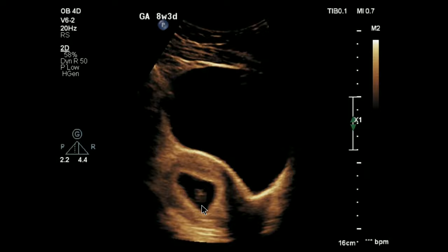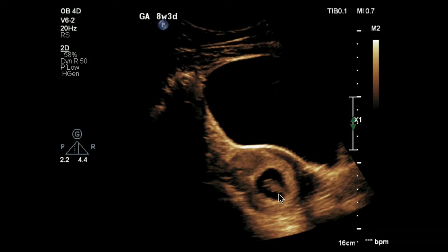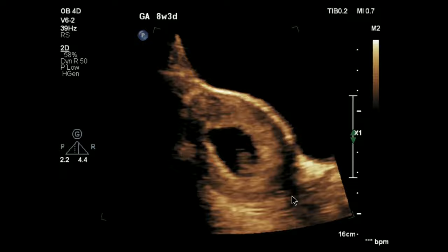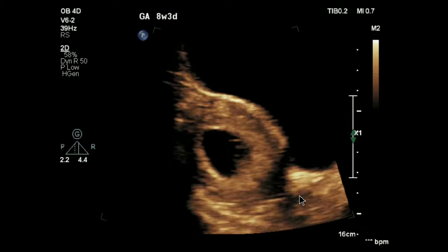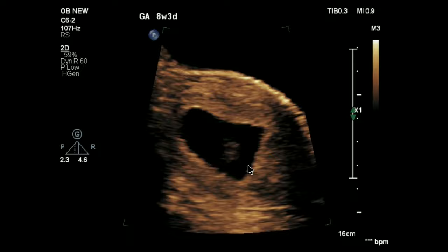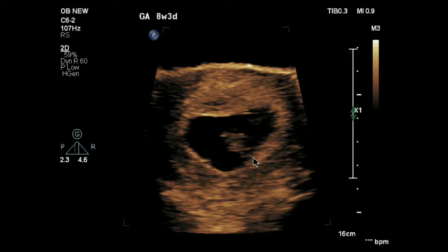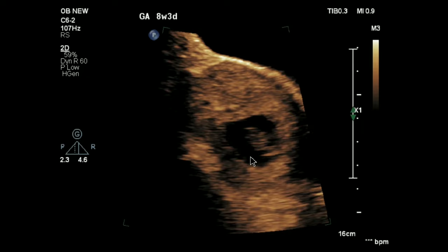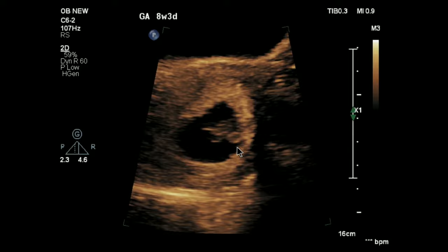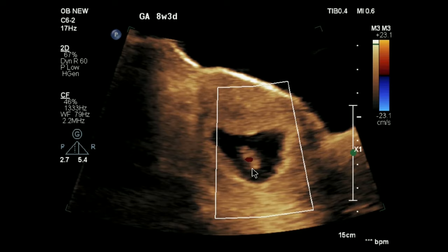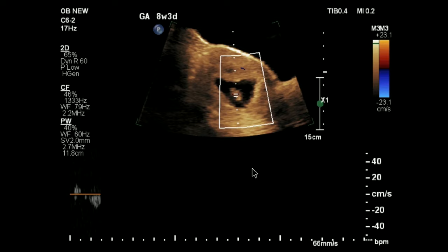Here you can see the gestational sac and embryo. Heart rate is visualized and better seen on a magnified image. There is an adnexal cyst which we will discuss later. Here we can see the yolk sac. Please do not think of the yolk sac as the fetal head. The yolk sac is a cystic structure, not the head. When you are seeing the yolk sac, you won't be able to differentiate the fetal head well from the body. And when you can easily identify the fetal head, then you won't be able to see the yolk sac well.